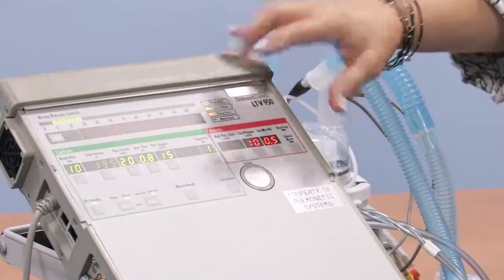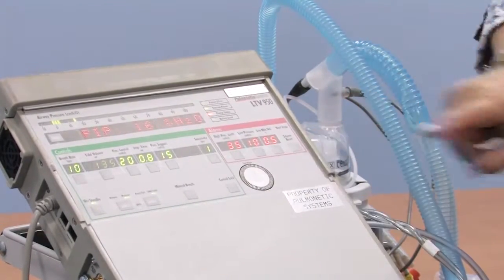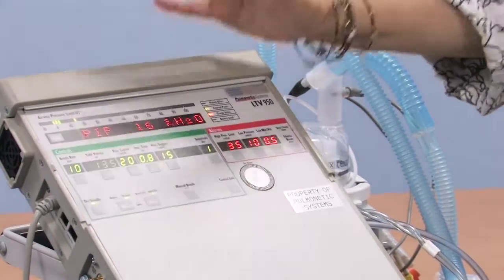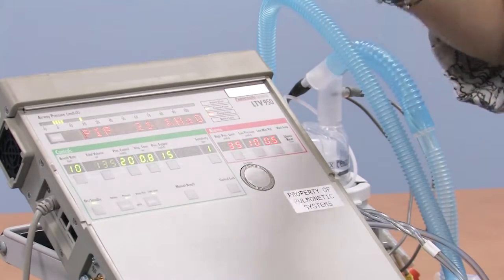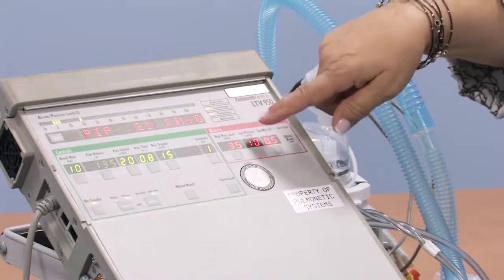Whenever an alarm goes off, until I reset it, this is the silence reset button, until I hit the button to clear it, it's going to continue to be on the screen. So if you're in another room and you hear an audible alarm and you come into the room where the child is and you look at it, it will tell you what alarm went off. In addition, they will be flashing.